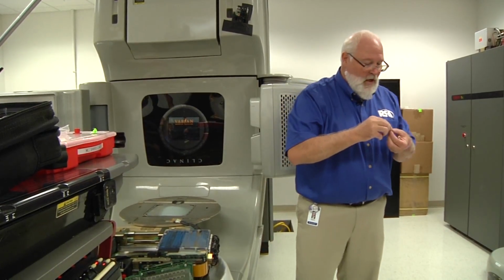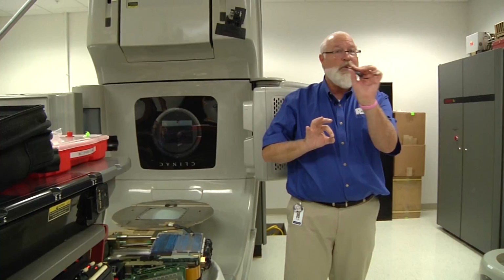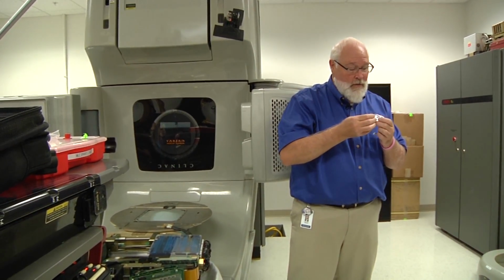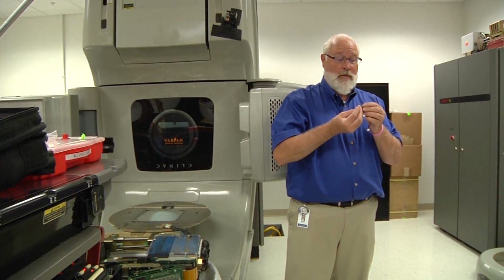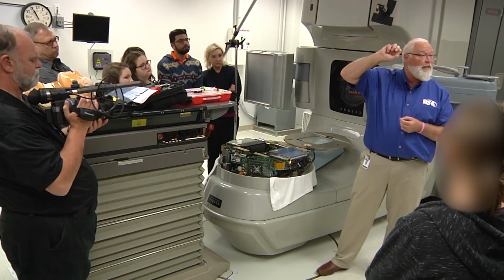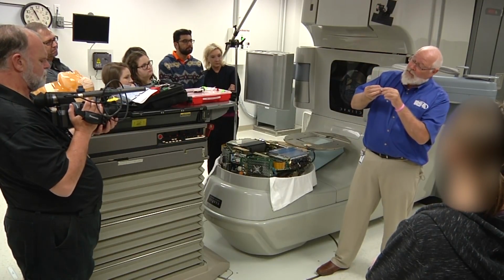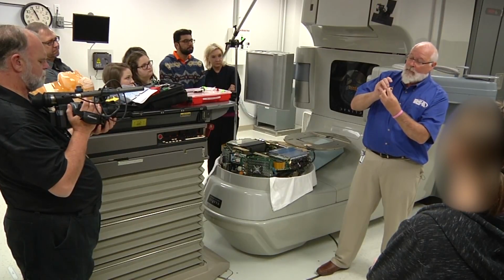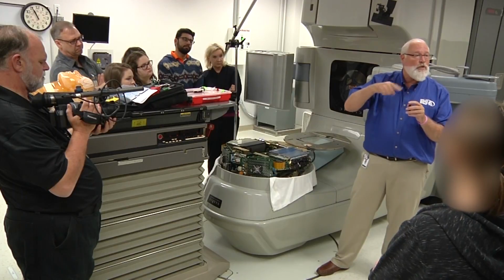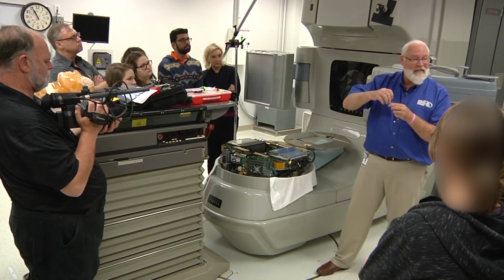But if you look at the coupler, there's a flat spot. And look at the motor, there's a flat spot. You want to match the flat spots together. Okay, I lied on this one. It's on your half leaf, there's a flat spot. Oh, there it is. Okay, so I got it in the flat spot. That means it won't spin inside the coupler.